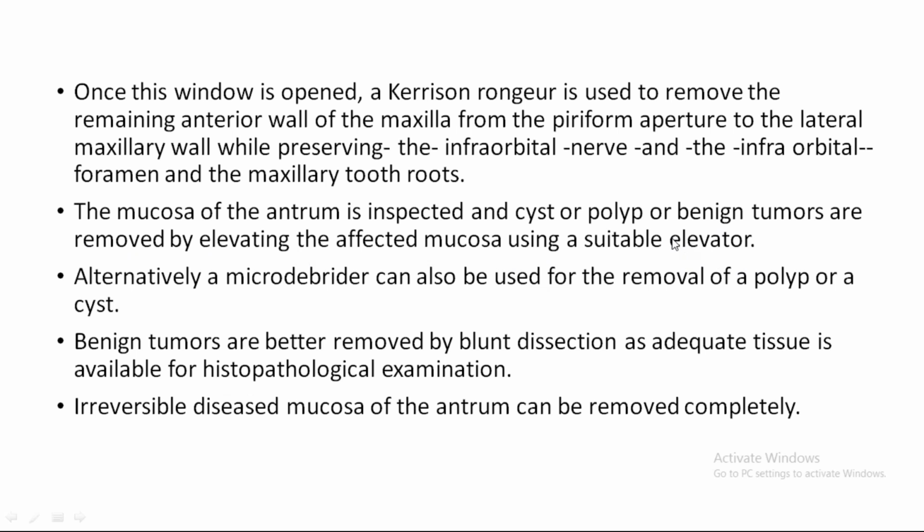After that, if you have an endoscope, you can also use it. You can use a 0-degree endoscope, or even an angled endoscope. The endoscope will tell you where the exact pathology is, so that you can use suitable instruments to remove the pathology.